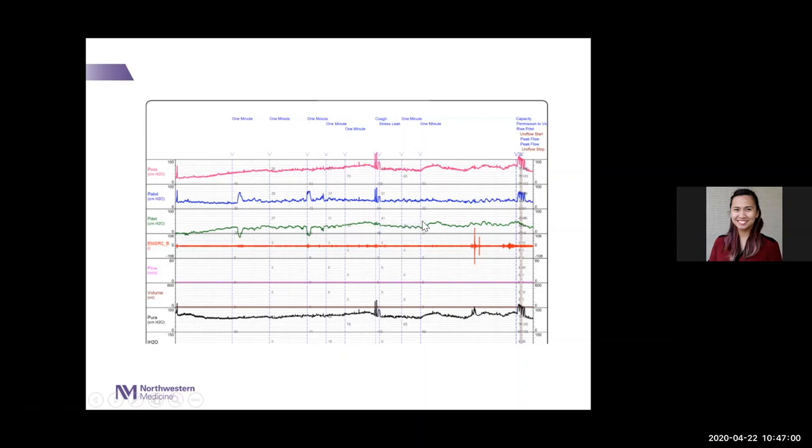So let's talk about what her compliance is. I think this is about 50 milliliters and she's already increased her pressure, from 0 to at least 20, if not more. And it kind of stays like that. It goes up some more here, but we only get her to about 100 milliliters. And then here at a pretty low volume, we have her cough. She does get a leak here, and you can see it on the blip there.